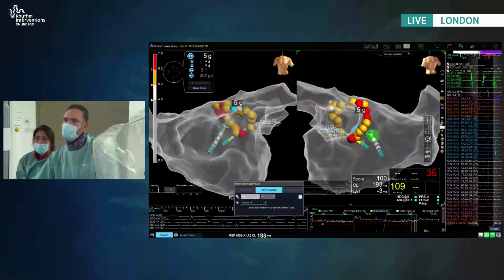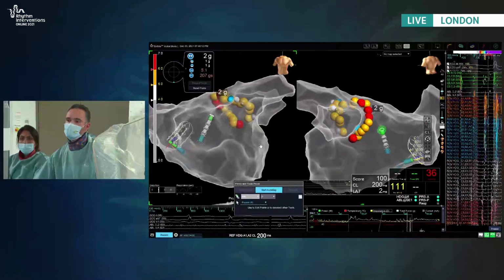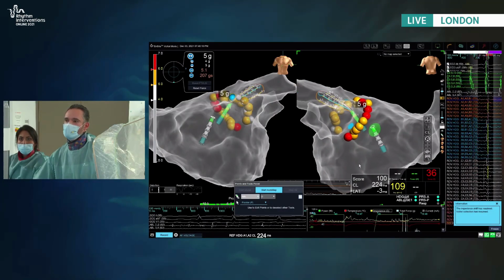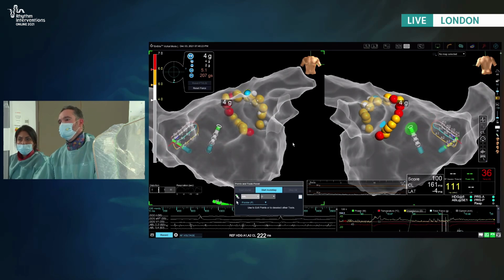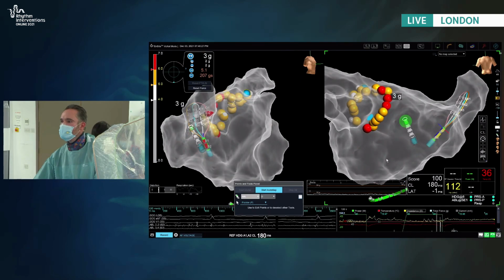Do you want to talk about how the HD grid contributes to that, perhaps? Yeah, so I trained mostly at Bart's and for a long time under Richard. It was quite fortunate that the period we were doing that was while AF ablation was evolving, and we were quite keen trying to ablate to sinus at that stage, as was popular at the time.